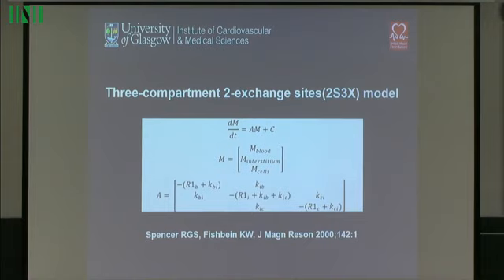We then incorporate these exchange processes into Bloch equations, and then compute our overall bulk vector m as a function of time. Then from that vector we infer what bulk relaxation rate R1 would give us that particular m, and then we try to minimize the departures between our measured values and fitted values, and we find the optimal values of parameters KIB and also a fractional volume of blood in the myocardium.